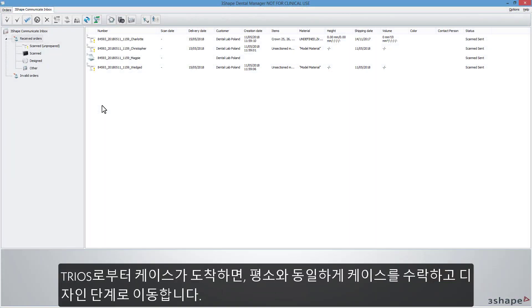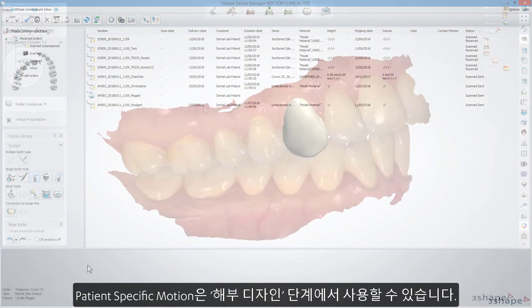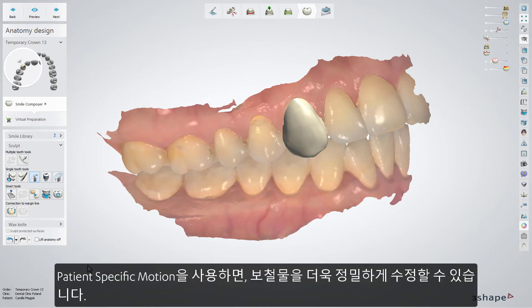When the case arrives from Trios, proceed as usual: accept the case and move to the designing stage. You can enable this option when you get to the Anatomy design step.